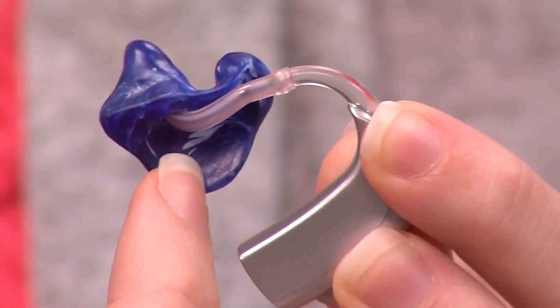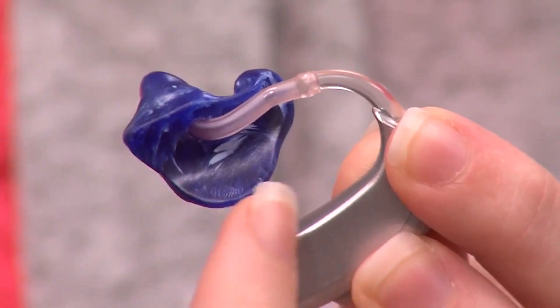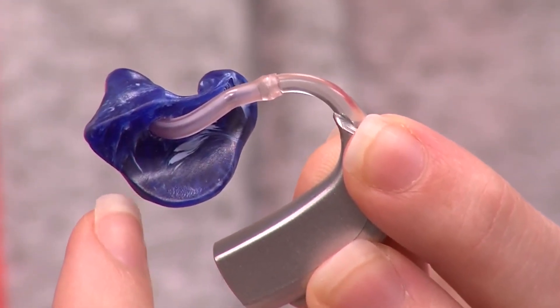Over time the tubing of an ear mold can become hard or brittle and can crack. This can cause pain or discomfort or change the sound quality of the hearing aid.